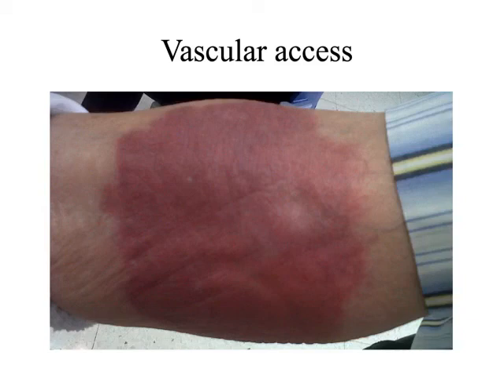So vascular access is very important. We'll talk about it a little bit more when we go over contrast. But just know that I want to make sure that my IV is good. It's not in any way compromised. Sometimes a little hep lock will come unscrewed and contrast is just pouring everywhere. You want to avoid that, but you also want to avoid any kind of extravasation.